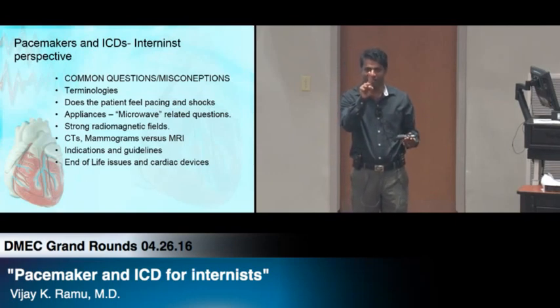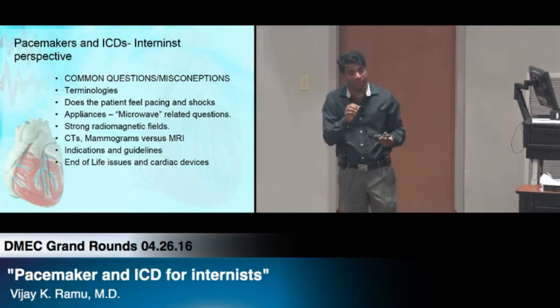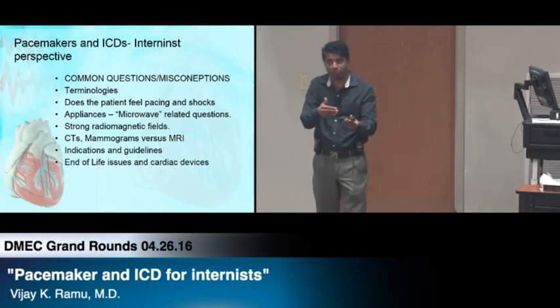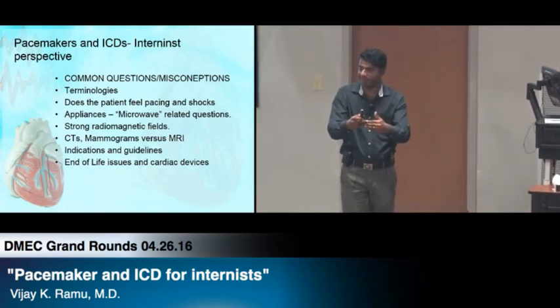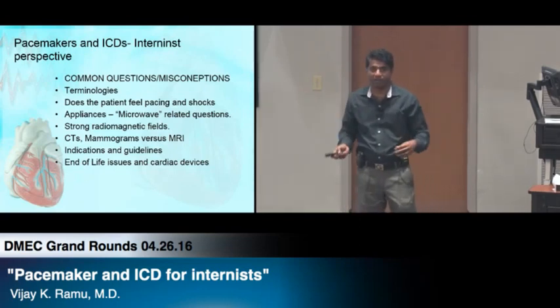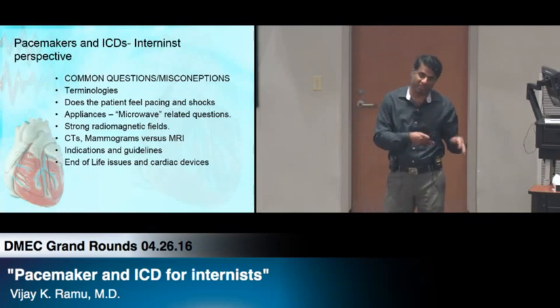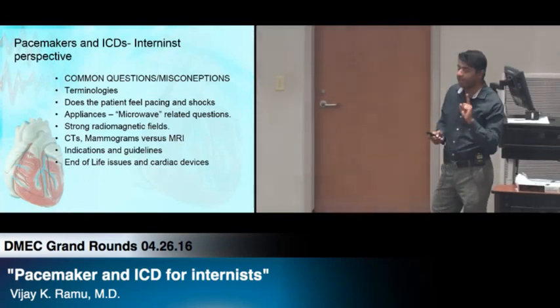The right atrial lead looks like it has a shadow because it's almost moving. It's taking a snapshot and it's moving so fast, it looks like there are two leads. So on CT scan, the heart and the pacemaker wires move differently, so it may sometimes project as though the lead is coming out. They usually train them, but I've had two radiologists call about this and the patient got scared and came to my clinic. Obviously we check the device and everything, and I say this is no big deal. But that's one thing you have to worry about.